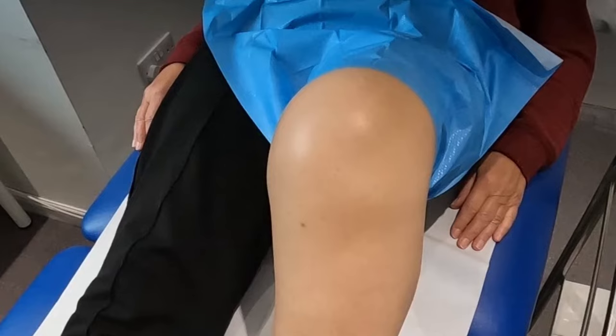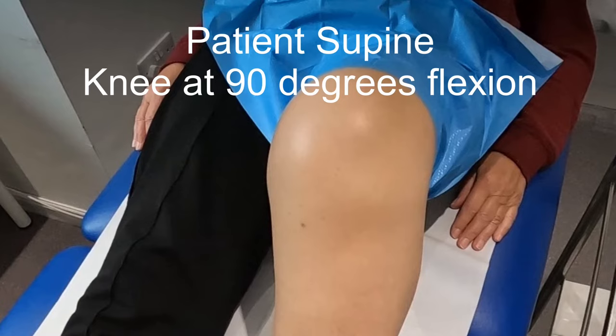This injection can be done with the patient in sitting with their knee flexed to 90 degrees, but the preferred position for both patient and therapist comfort is supine with the knee flexed comfortably to around 90 degrees.